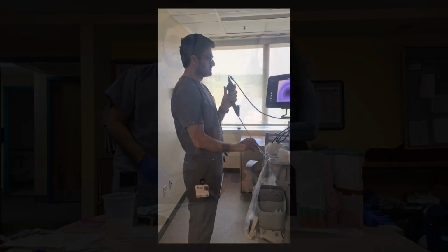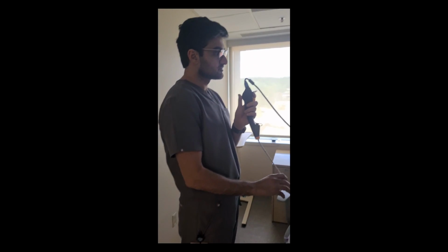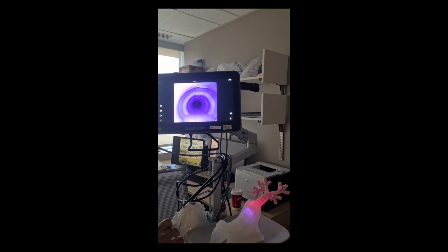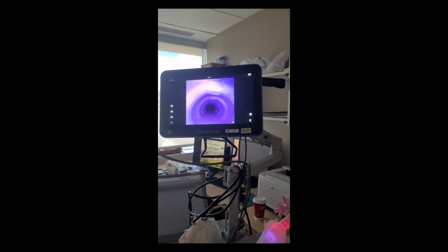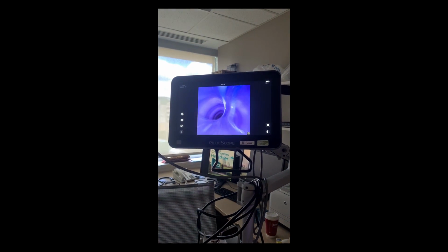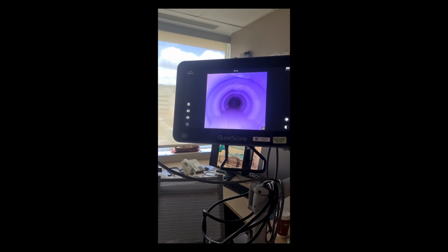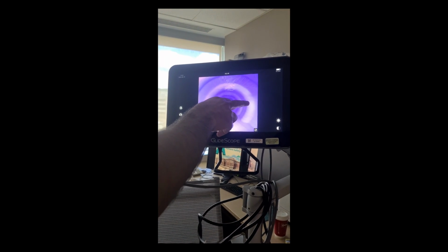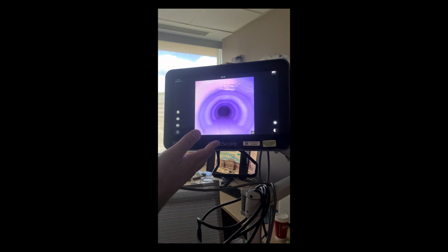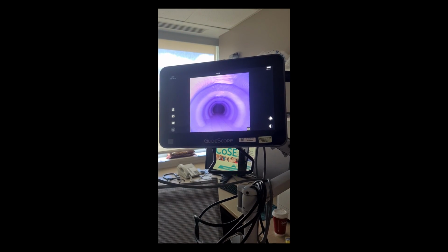So we're going to start with the first trial run of the bronchoscope. We've got Dr. Hamid here. This is a 3D printed model of the lung. What you're looking at right now is the interior of the trachea. You can see this is the endotracheal tube. Once you come out of the endotracheal tube, this is the anterior side of the trachea, the posterior side, and you can actually see how good the 3D model is, because you have the cartilages that are anterior and you have the membrane that's posterior.